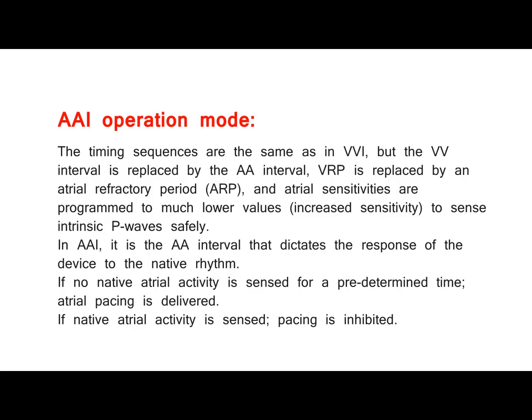In AAI, it is the AA interval that dictates the response of the device to the native rhythm. If no native atrial activity is sensed for a predetermined time, atrial pacing is delivered. If native atrial activity is sensed, pacing is inhibited.